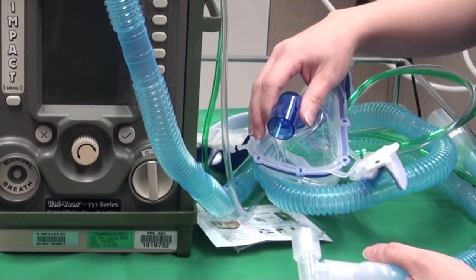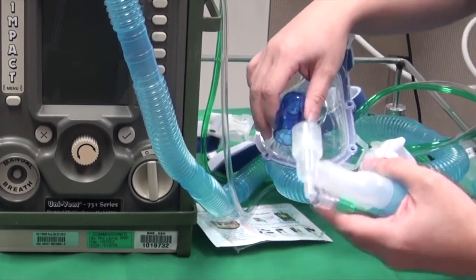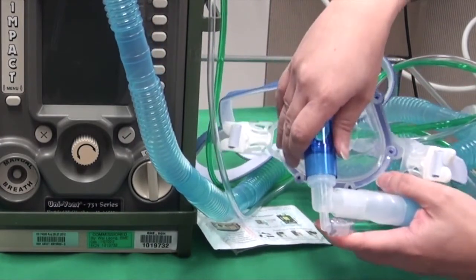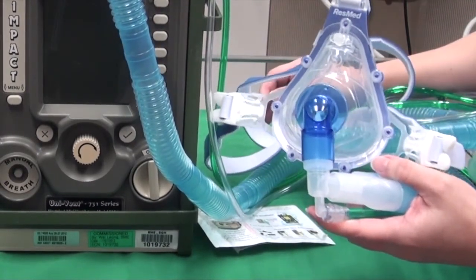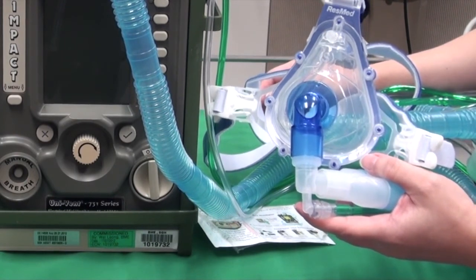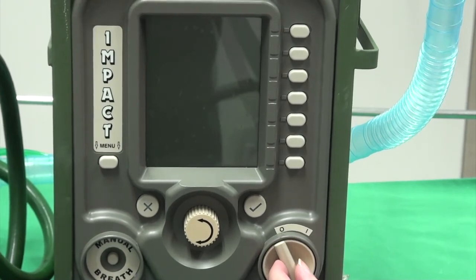You can also use the impact ventilator as an acute NIV setup. Instead of connecting this to an ETT, you can connect this to an NIV mask. For more details about the setup of the impact ventilator, please refer to the introductory video of the ZOLL Impact EMV Plus ventilator. Turn on the impact ventilator.